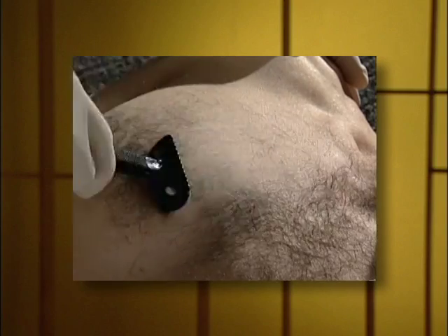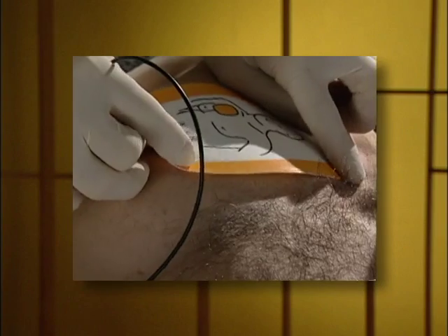Now, if there's a lot of hair on the patient's chest, you can use a razor to quickly shave their chest where the pad will go. Some versions of the LifePAK AED come with a kit that includes a razor. If it's just a little hair, go ahead and stick the pads on over the hair. The important thing is that the whole pad makes good contact with the skin.